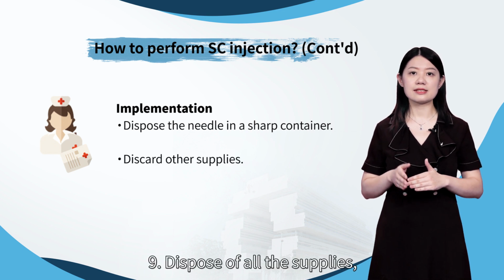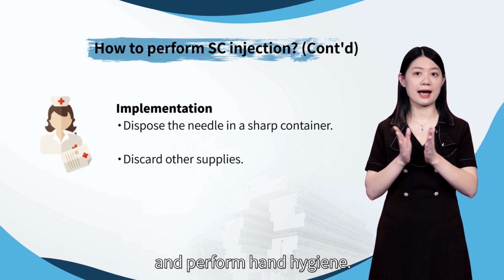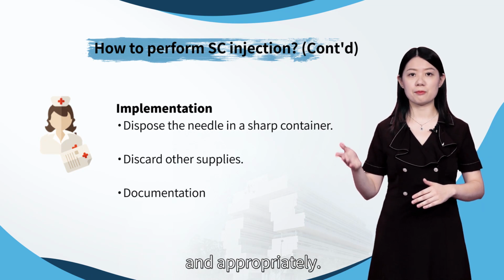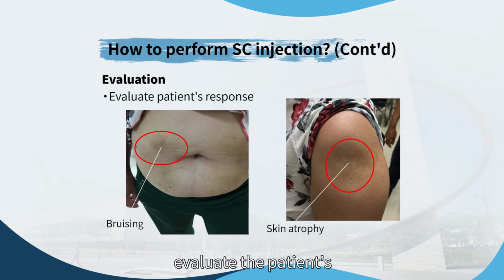Ninth, dispose of all the supplies, remove the gloves, and perform hand hygiene. Document the procedure and findings accurately and appropriately. After that, we should evaluate the patient's response to the injection.